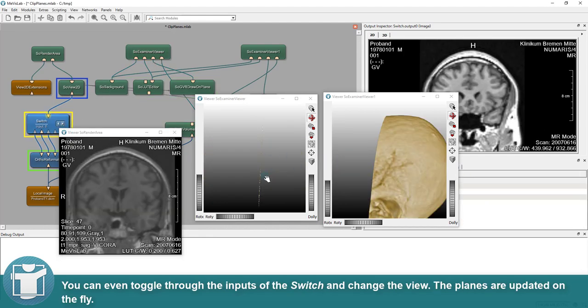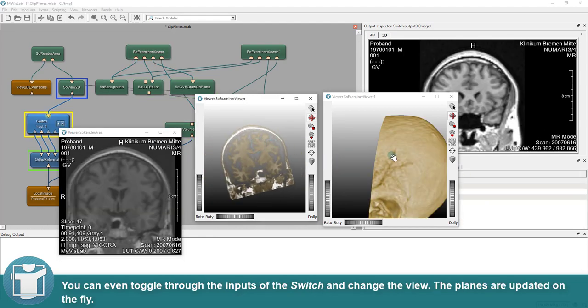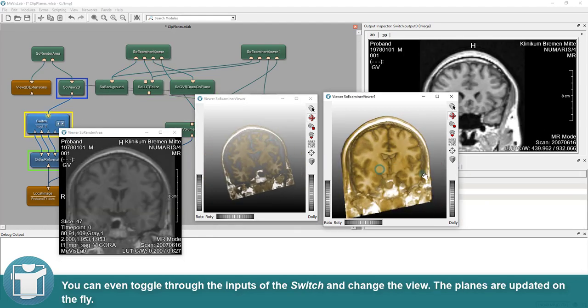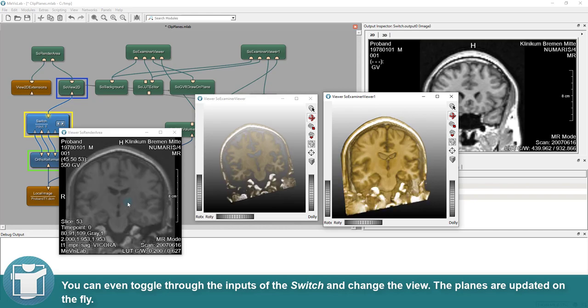You can even toggle through the inputs of the switch and change the view. The planes are updated on the fly.